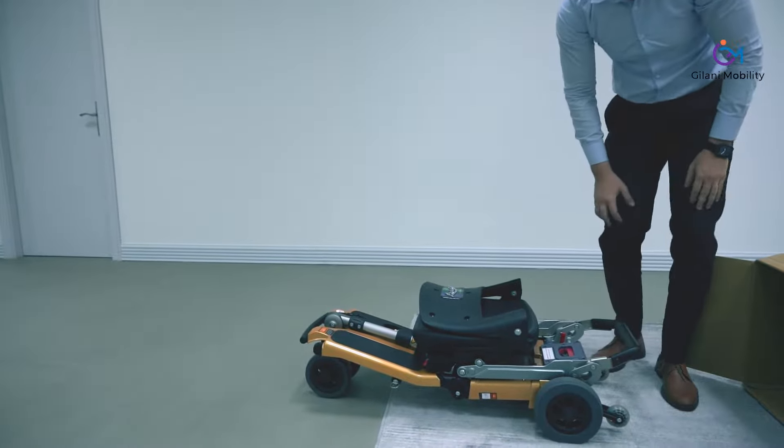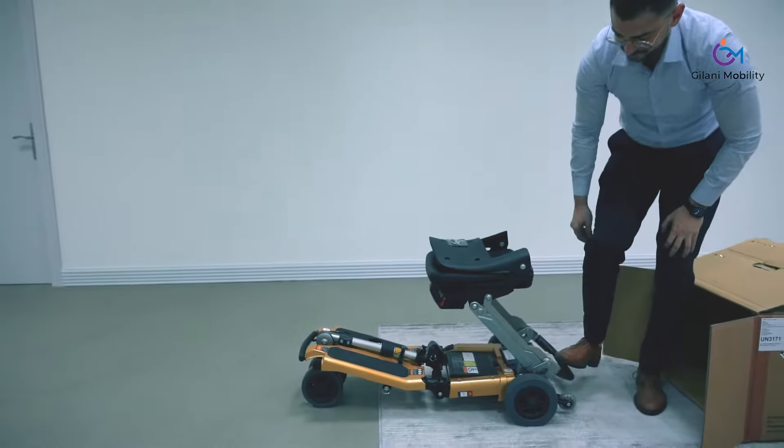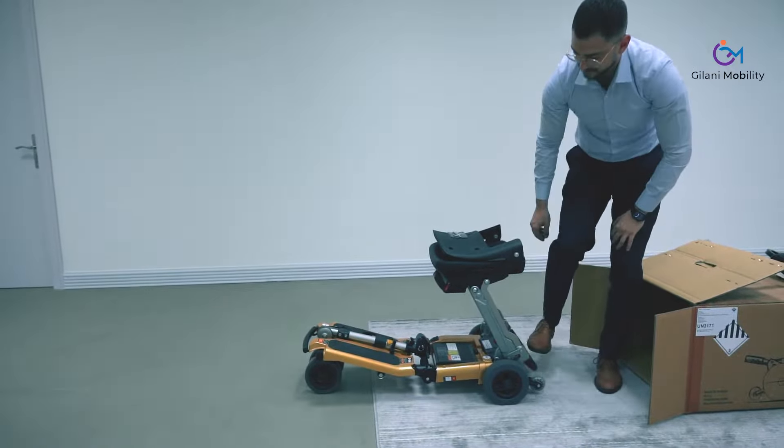The scooter can easily be unfolded — you use the weight of your leg. The seat is also adjustable to different heights, as you can see here. That was a lower setting and now it is up at the higher setting.